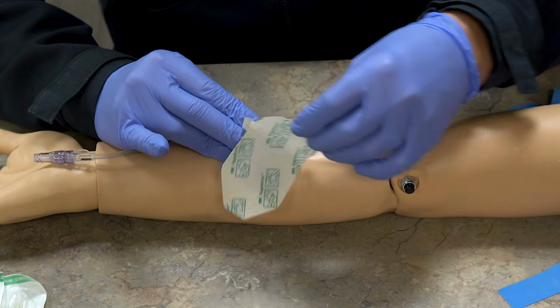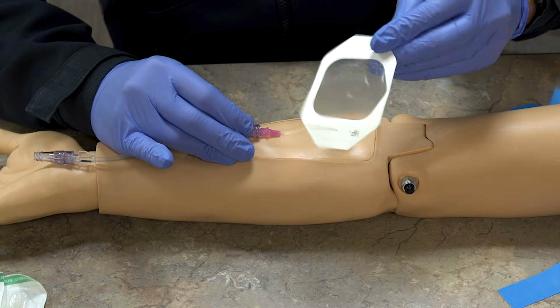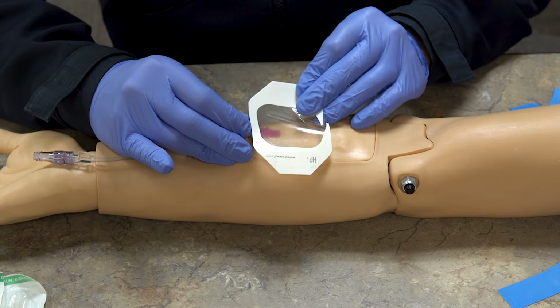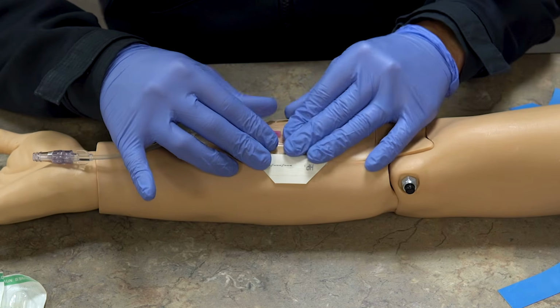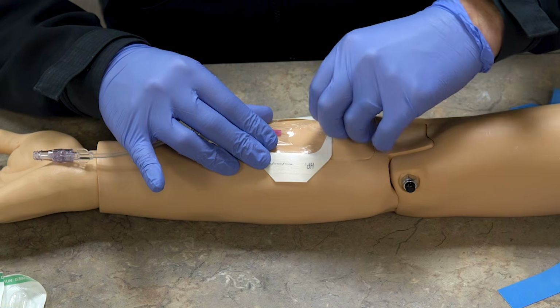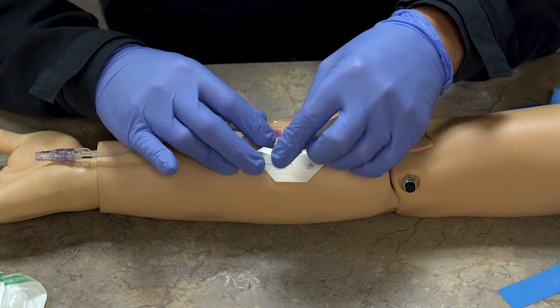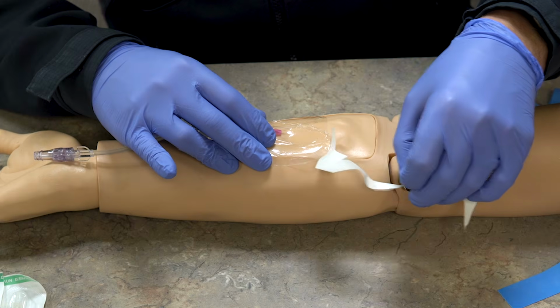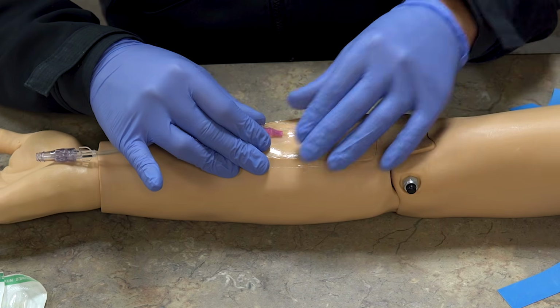I'm going to then take a Tegaderm, and there are a lot of different ways to put these on. I'm just going to put it right over that hub, push it down, and this is going to prevent infections. It's going to make sure that the site stays clean. It's also going to help hold it in the skin. And you're going to remove that and just smooth that Tegaderm down.